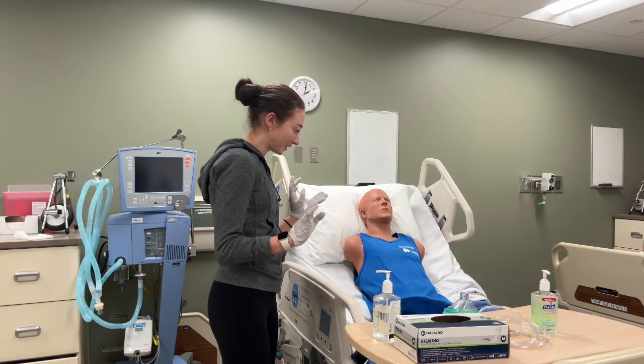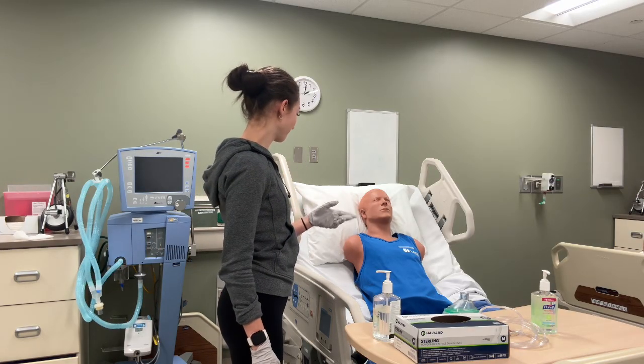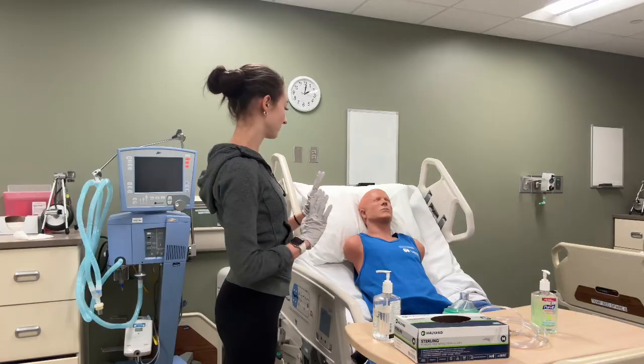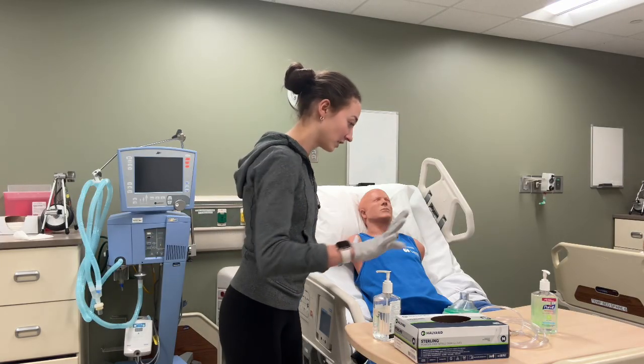So I'm going to do an overall assessment — listen to your lungs. Sound good. Heart rate's good, respiratory rate's good. That is good.